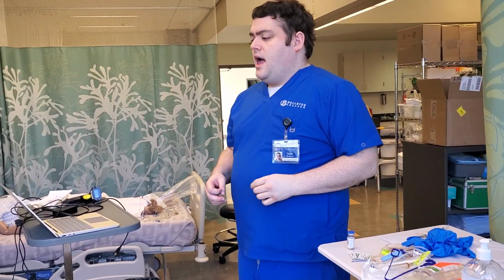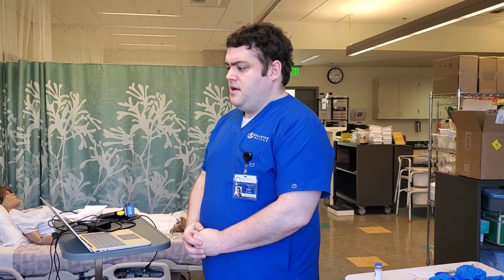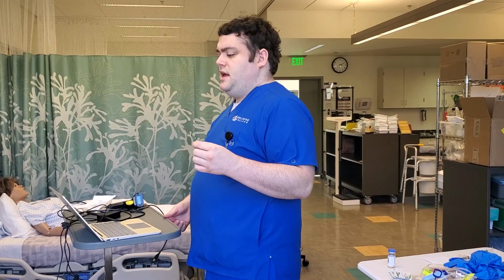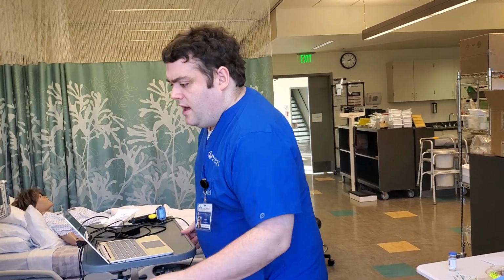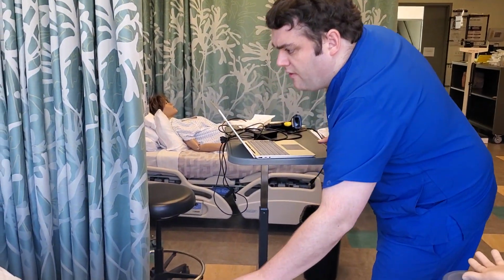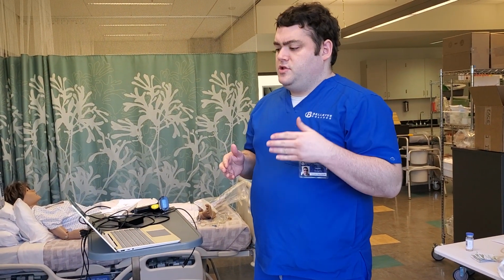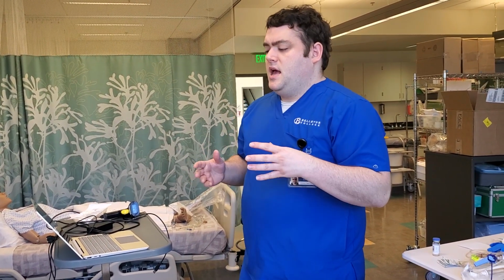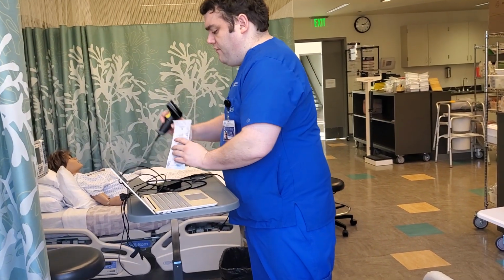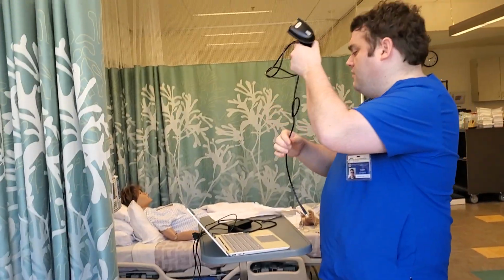Hi, my name is Kevin and I'm going to be your nurse today. I'm going to give you some medicine. Can you give me your name and date of birth? Okay, checking here, she confirms that it matches. Before we go on, are there any allergies that you have? She confirms to me that she has none. Then we'll scan her in.